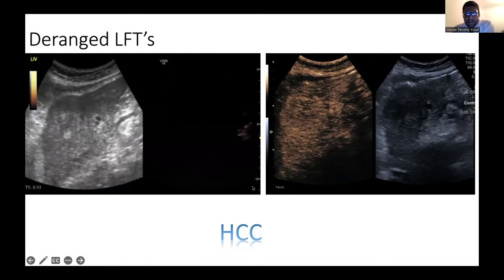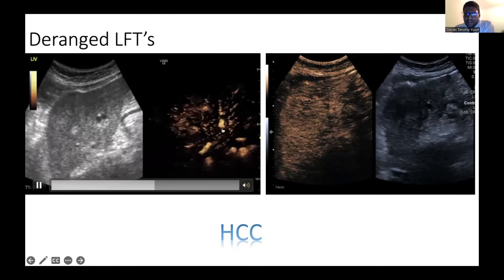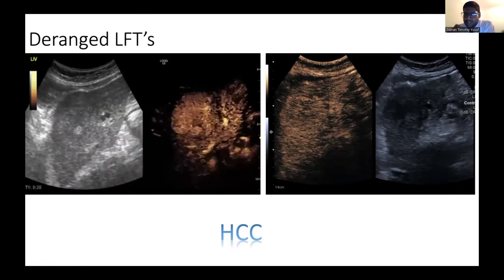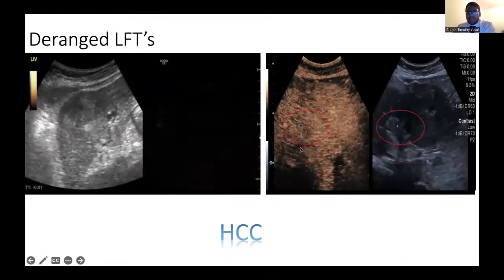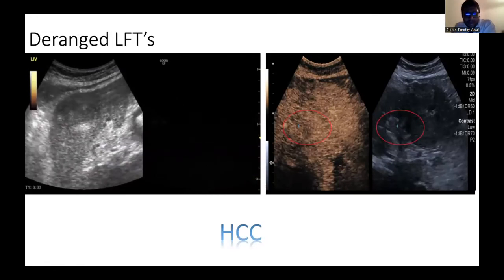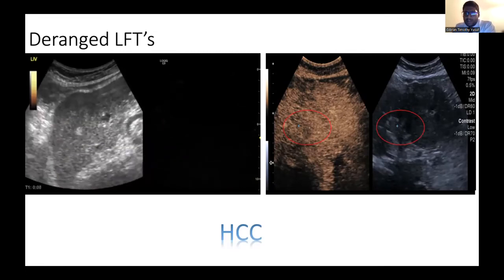As you see, the arterial phase is coming in now. You can see the complexity of that arterial pattern enhancing quicker than the background liver. You're not seeing a snapshot, you're seeing it in real time. It's also very sensitive because what you can pick up here, that is the portal vein, and that is washout inside the portal vein. So this was LI-RADS TIV, tumor in vein. So this is diagnostic of HCC with portal venous malignant thrombus.